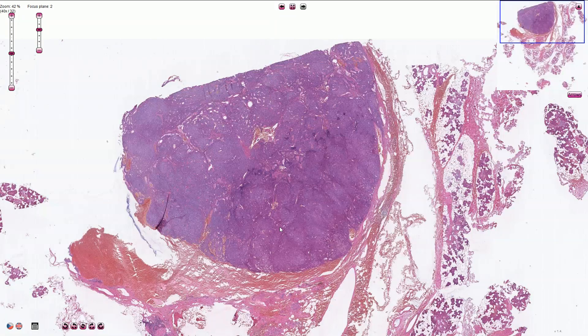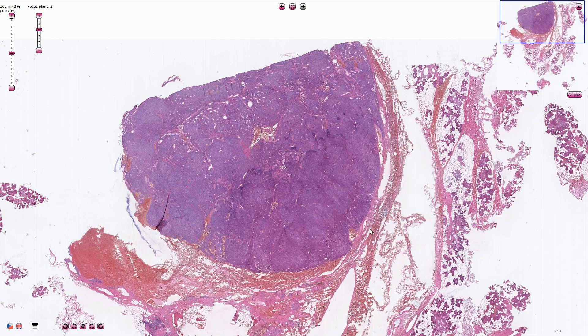Basal cell adenoma is a benign salivary gland epithelial neoplasm which is composed of small basaloid cells without myxochondroid matrix. The lesion is typically well circumscribed without infiltrative type of growth, and it most commonly occurs in the parotid gland.